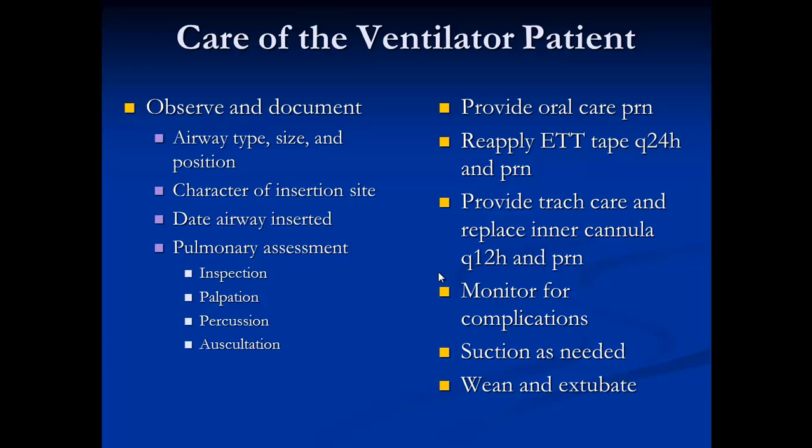You start with a 5 and you increase slowly as tolerated or required by the clinical condition if it's necessary. PEEP greater than 15 is rarely necessary unless the patients have ARDS. Set the trigger sensitivity, set the apnea alarms.